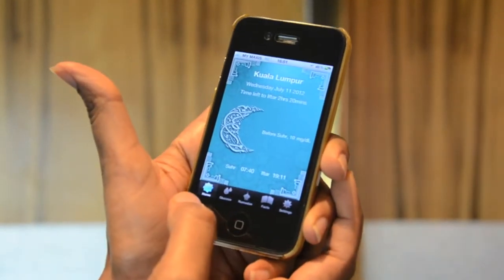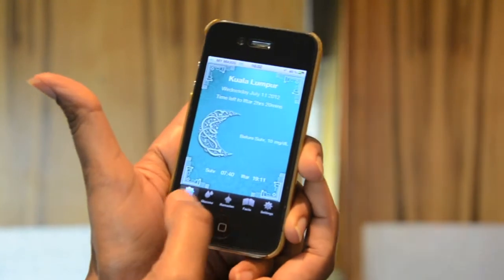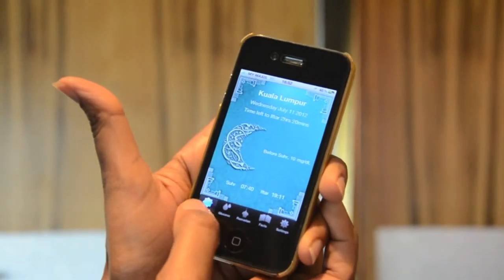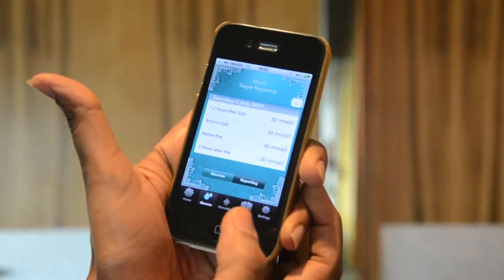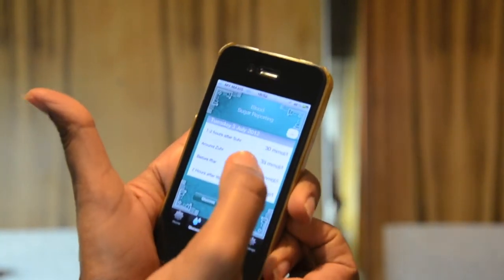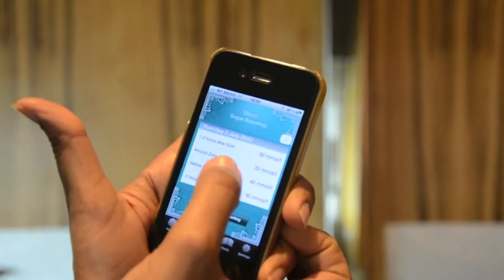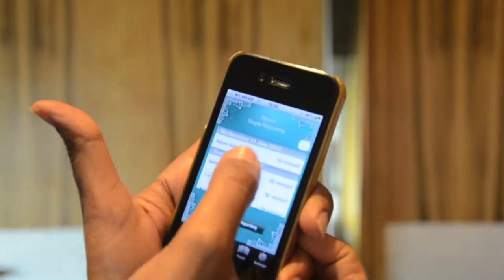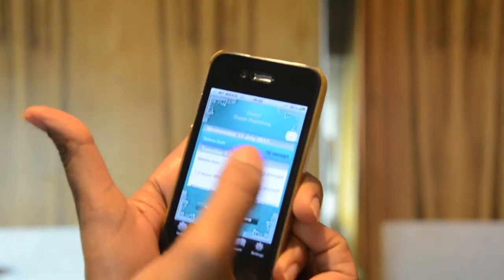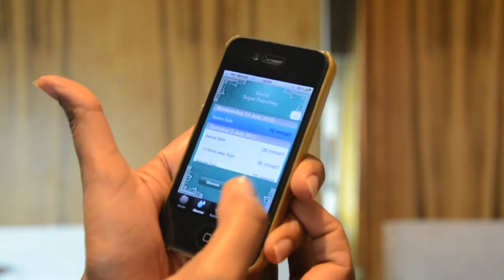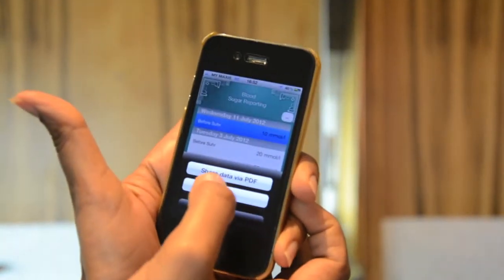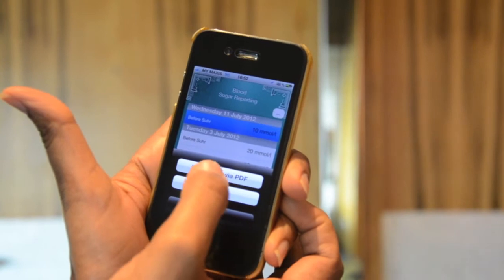Just to give you a demonstration, there are five key tabs at the bottom. What you need to do is go under glucose, first prick your finger, and put in the information. So let's say before Suhoor I am 10 mmol — I put in this, and then when I press that, I can actually share the data via PDF.